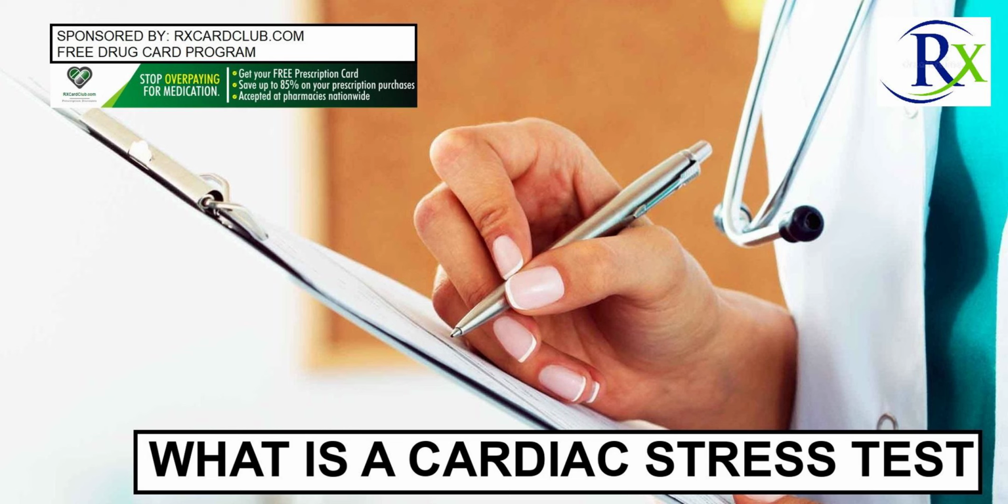According to research from the American College of Cardiology, the sensitivity of a cardiac stress test without imaging is 68%, while its specificity is 77%. Sensitivity refers to a test's ability to render a correct positive diagnosis, while specificity refers to its ability to render a correct negative diagnosis.